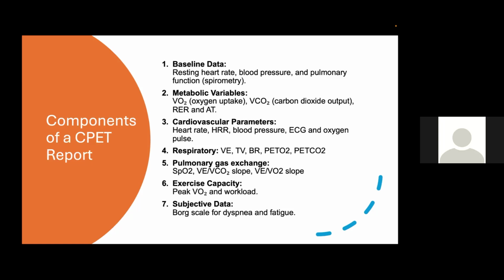In the respiratory, we look for the minute ventilation, tidal volume, and breathing reserve, and end-tidal O2 and end-tidal CO2. And at the level of the pulmonary gas exchange, we look for the saturation level and the slope, minute ventilation to CO2 slope or minute ventilation to VO2 slope.